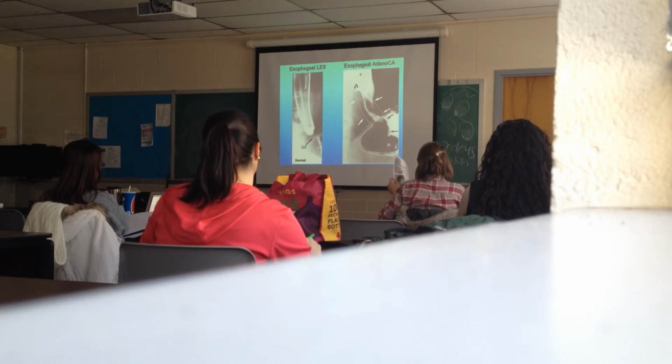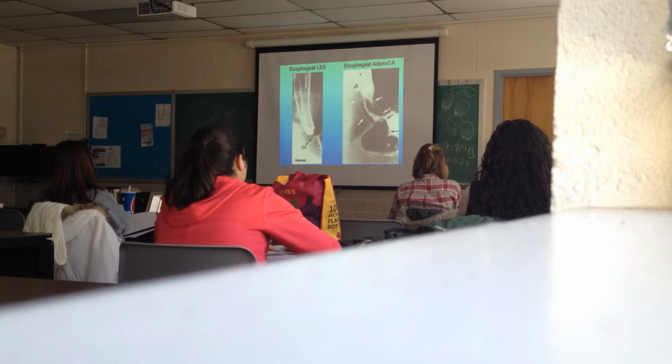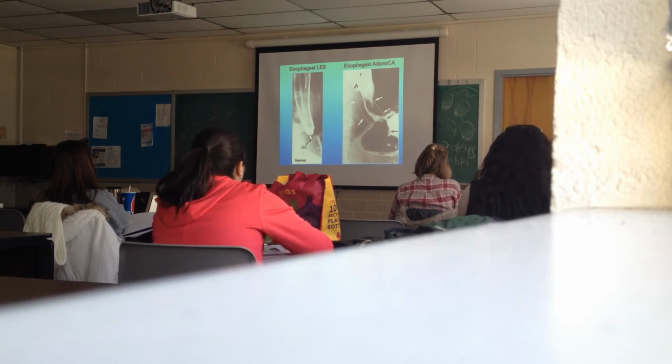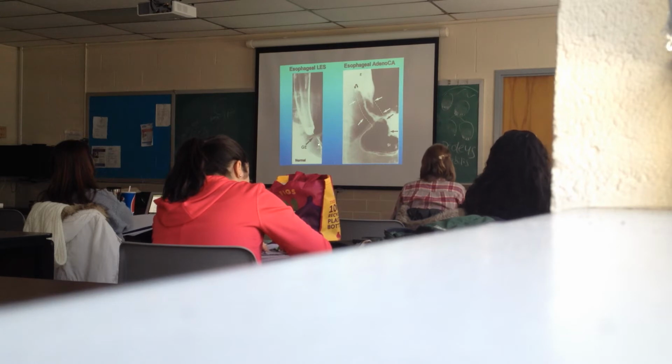Okay, we examined adenocarcinoma of the esophagus. It typically develops just in the distal one-third of the esophagus. Again, we have normal here for comparison. Looking at the distal esophagus, there is the distalmost portion of the esophagus. There is the LES right there. The esophagogastric junction is there.